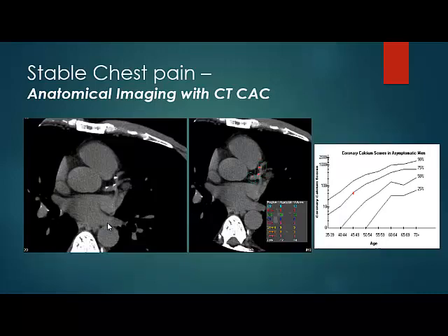Starting with a non-invasive technique for coronary artery imaging, you have the crude basic coronary calcium scoring. Calcification in the coronary arteries on these uncontrasted scans means that these are calcified plaques. The more plaque you have, the more chances of there being obstructive disease.